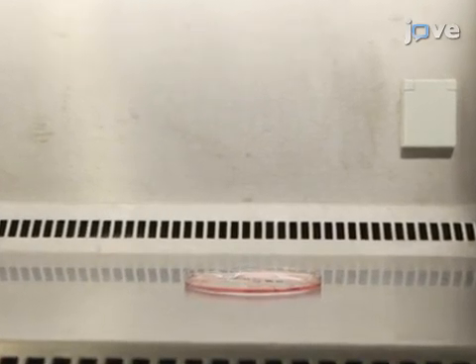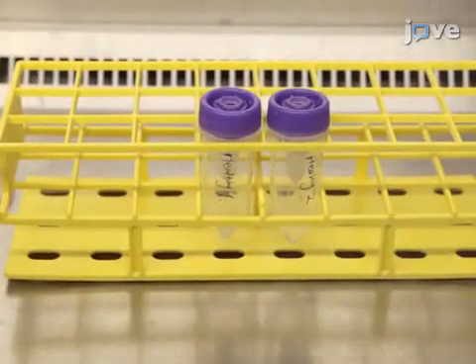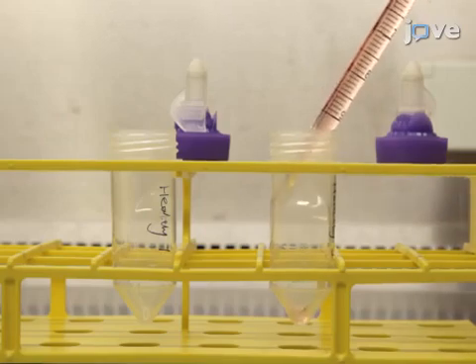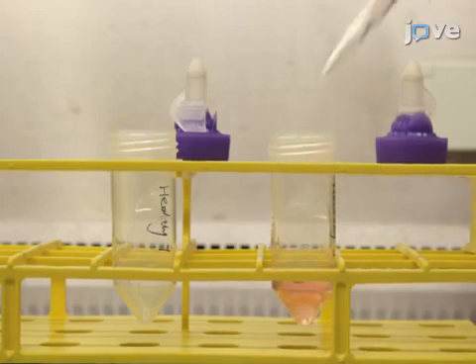While the biopsy is incubating, label a blue capped dissociation tube and add five milliliters of complete culture medium. Next, use sterile tools to place the biopsy into the dissociation tube.